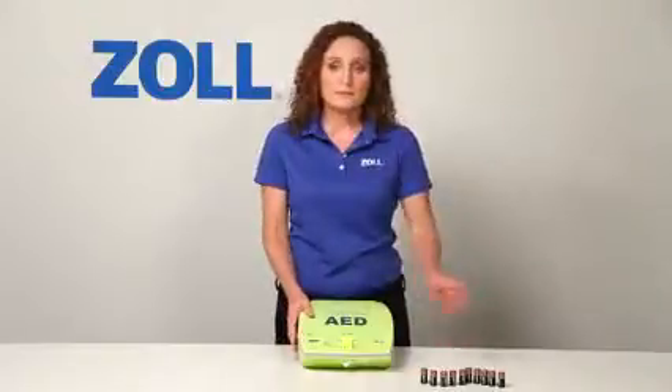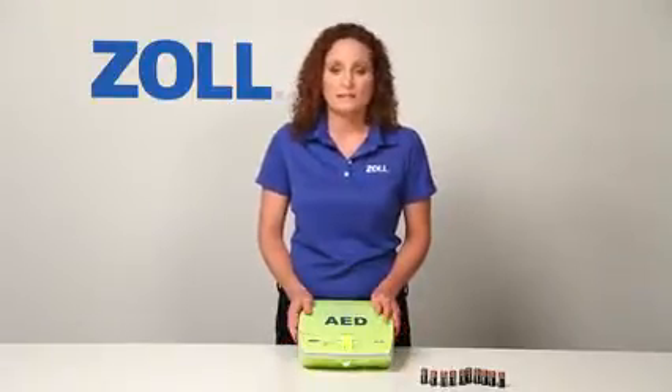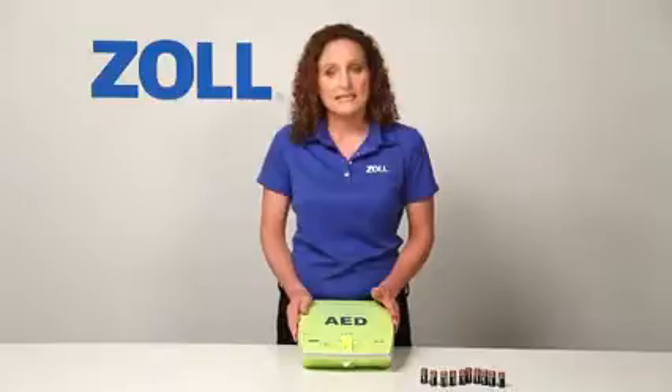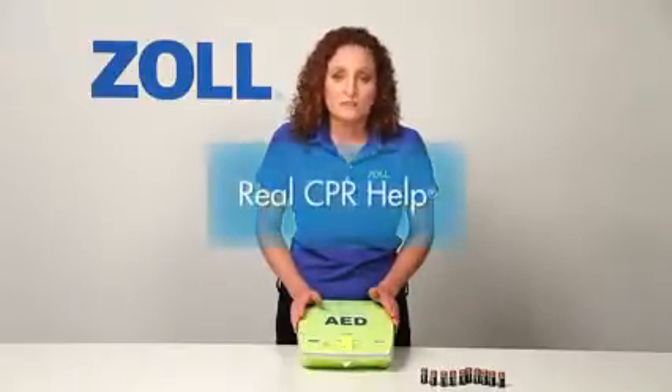This has been a quick demonstration of what makes the AED Plus better than other AEDs. It has the lowest total cost of ownership once installed because pads and batteries don't need to be replaced for 5 years unless used in a rescue. It has the highest ingress protection rating for particles and water of any AED from any major manufacturer, and it's powered by retail lithium batteries instead of an expensive proprietary battery pack. But most importantly, when it's time to do CPR, only the AED Plus provides real CPR help.